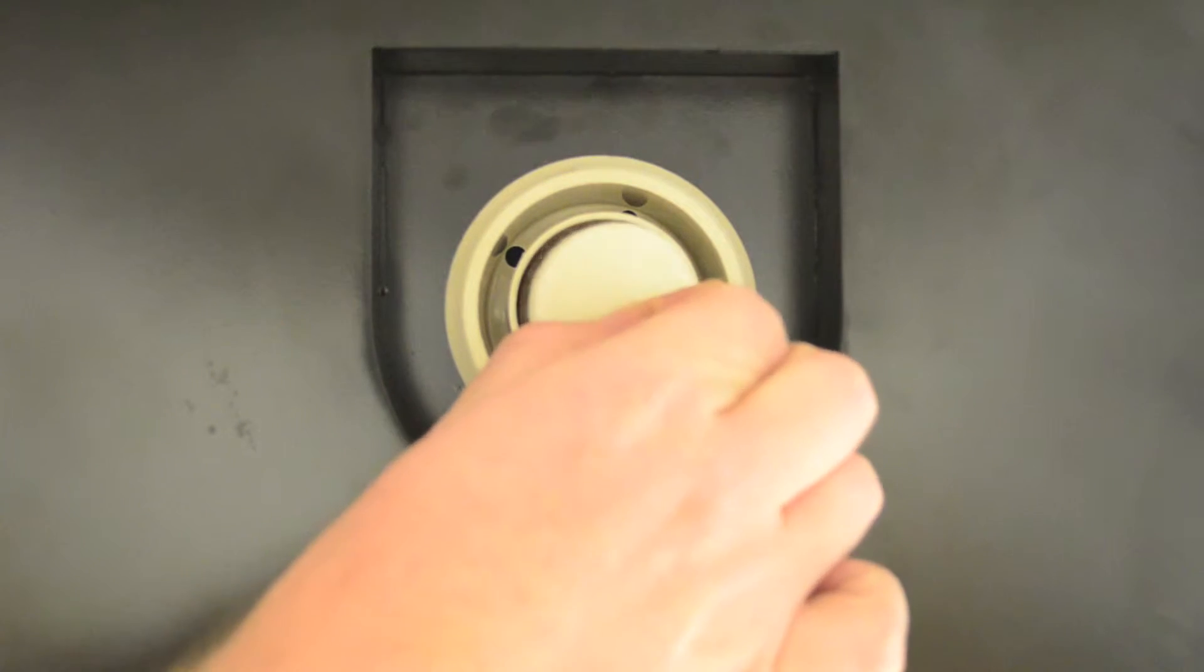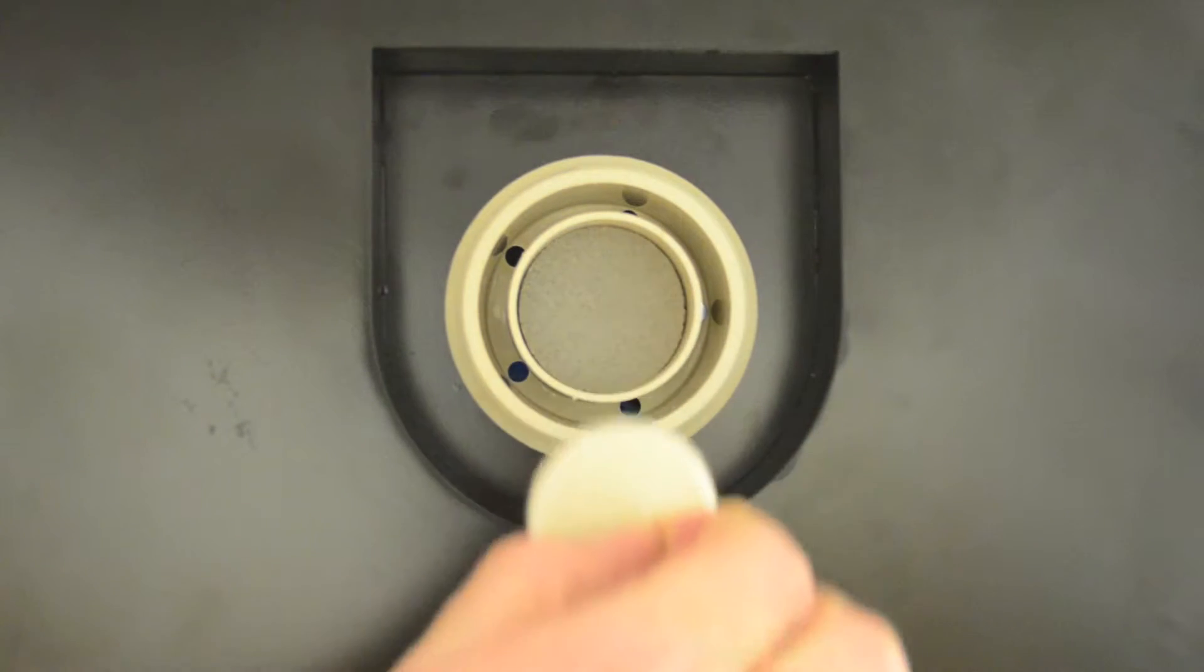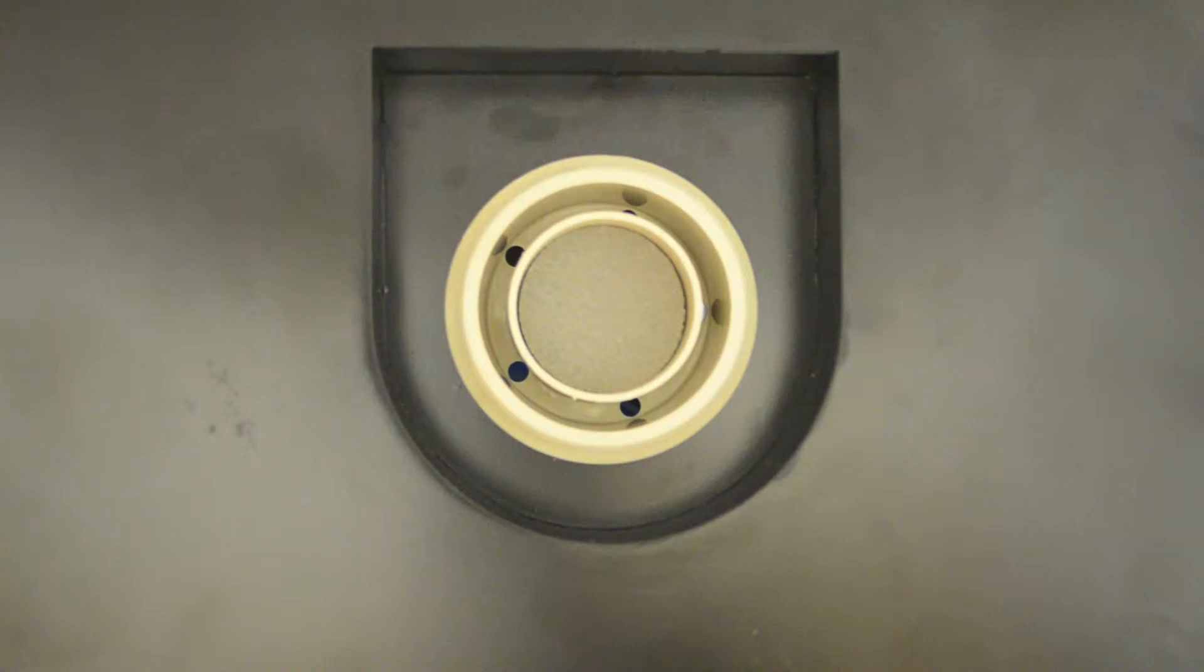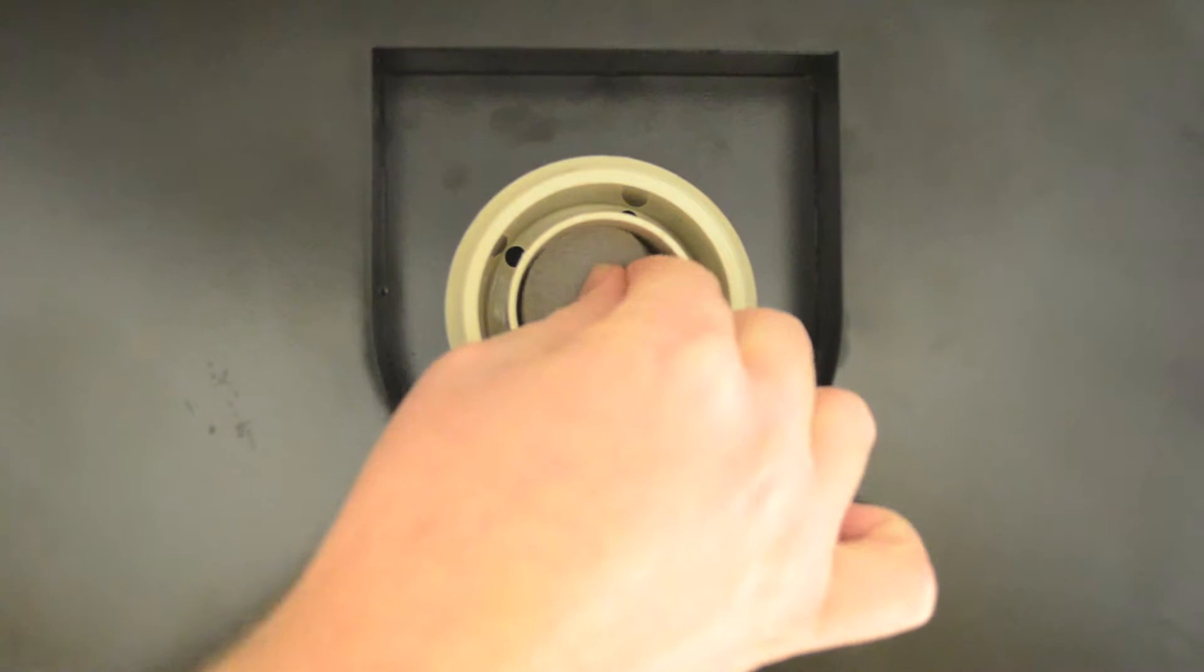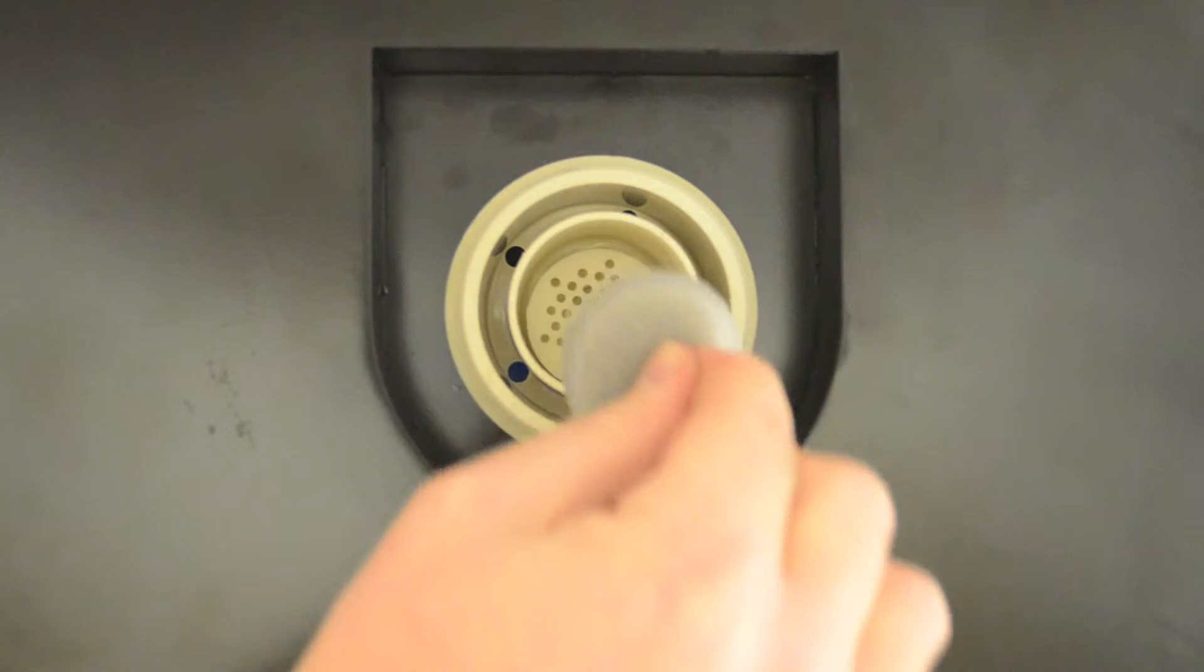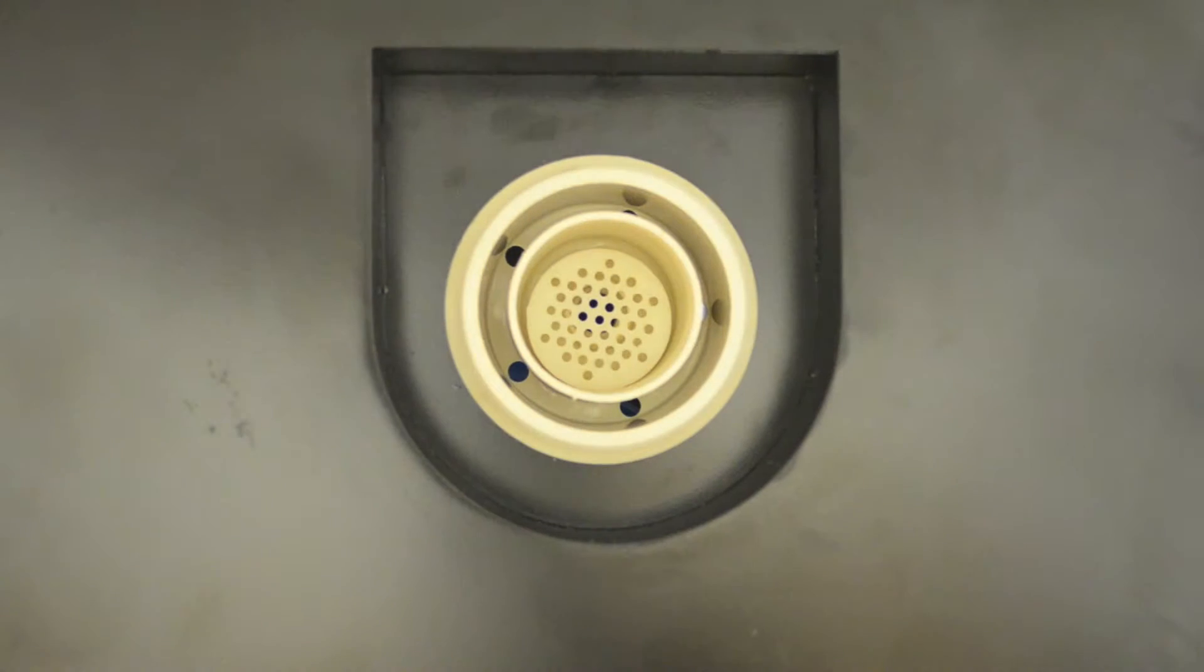Inside the filter you will find one white filter and a gray foam spacing insert.